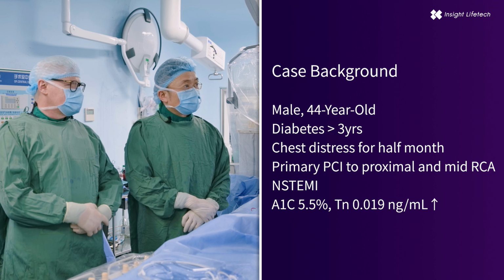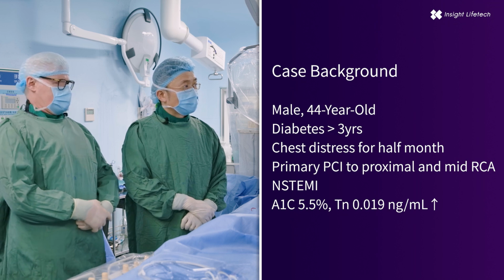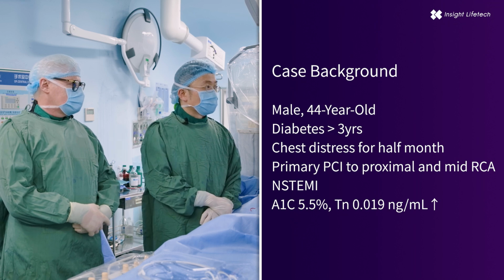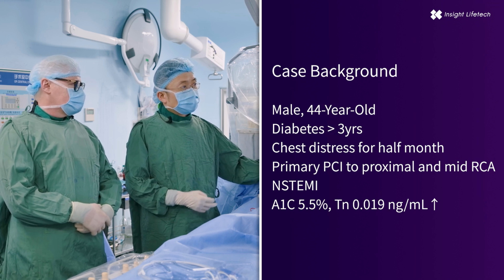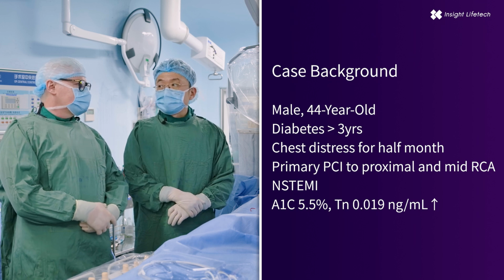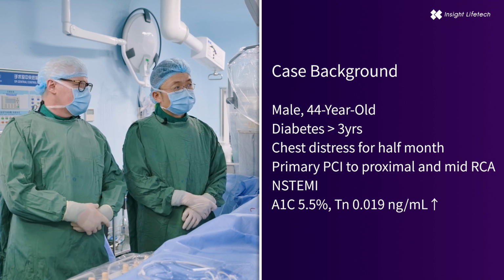Briefly, this gentleman had an acute inferior myocardial infarction 1 month ago and was successfully treated with primary PCI in a local county hospital. Today we can see the RCA stent is well patent, and the electrocardiogram shows only a small Q wave in lead 3. The vessel was opened very early, so most of the myocardium is preserved.